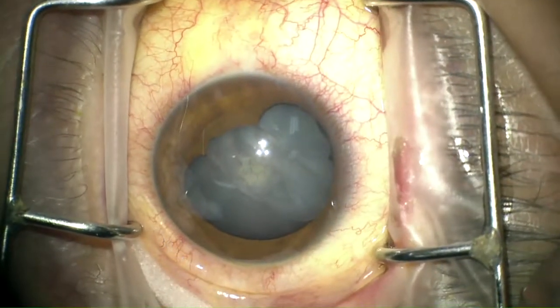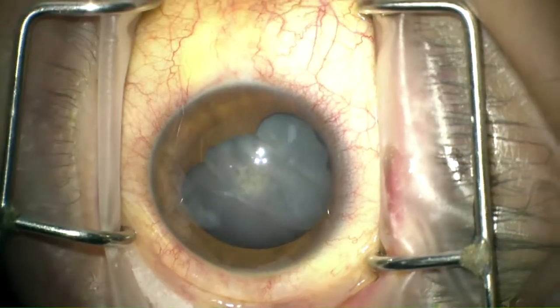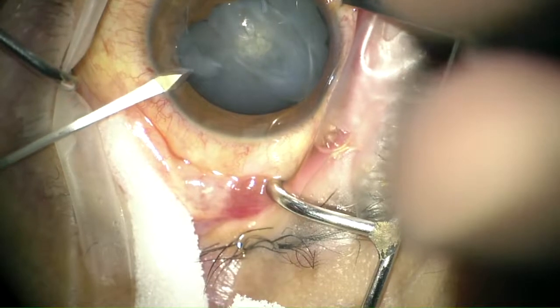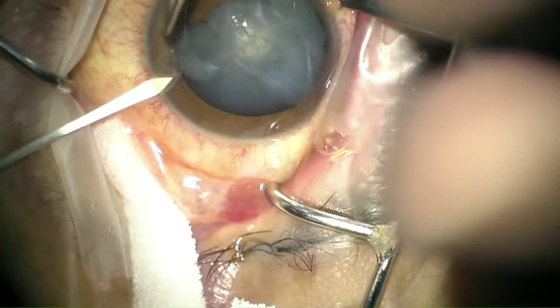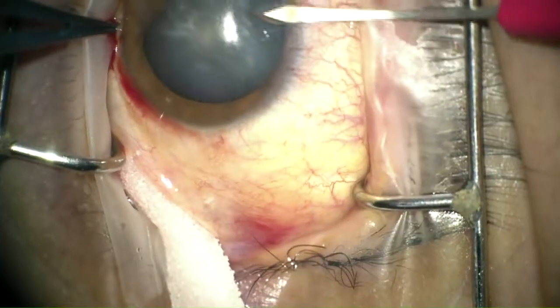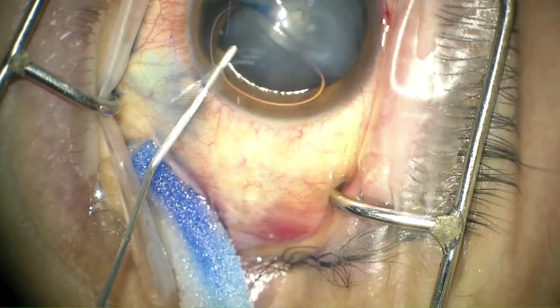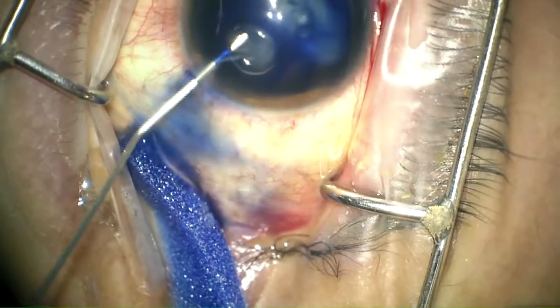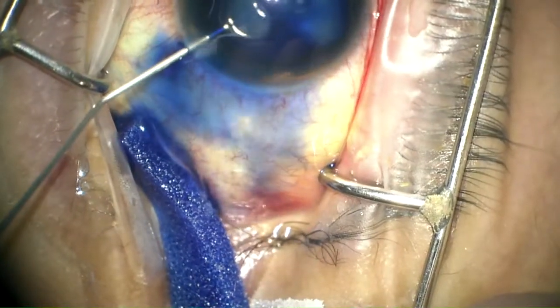The procedure started by making two paracenteses 180 degrees from each other to facilitate the use of a bimanual irrigation-aspiration technique. Then vision blue was injected into the anterior chamber to enhance the visibility of the anterior capsule.